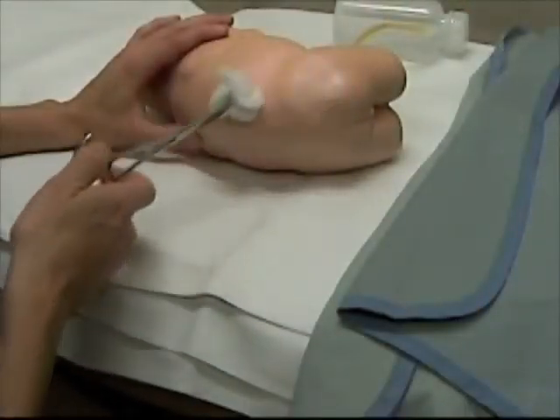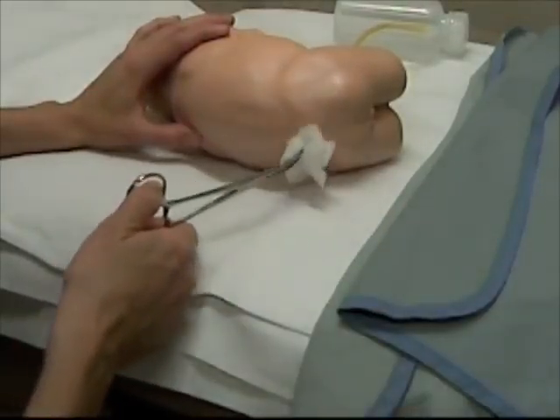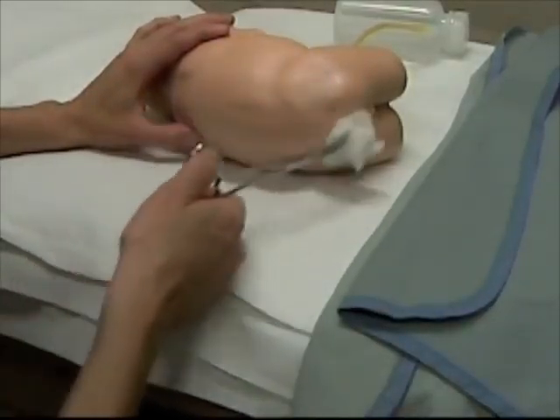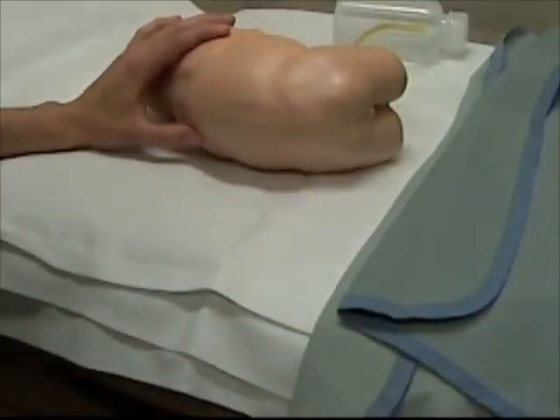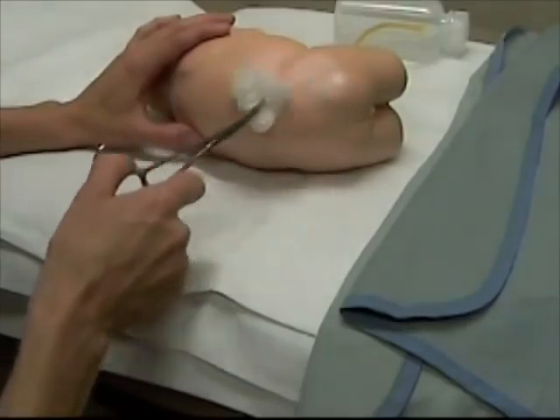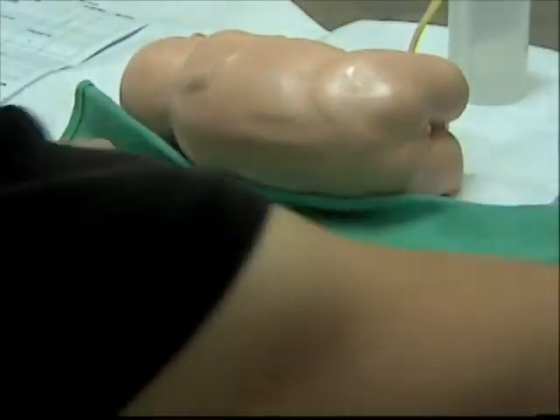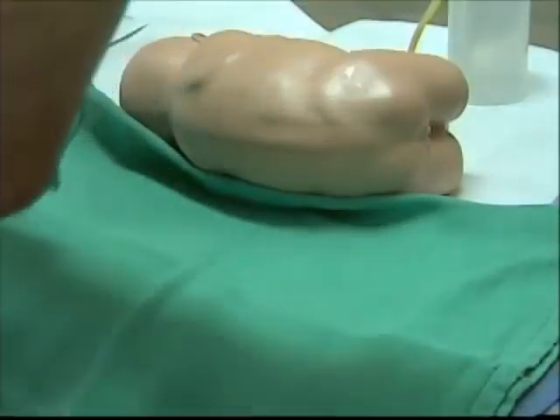Cleaning of the site should be performed in a circular motion, working from the inside out. Clean well beyond the area you will drape with chlorhexidine and betadine. Do this 3 times. The baby's diaper should be off by this point. Place your drapes so as to create an opening through which everything is sterile. There are a number of different ways to drape the child. One is shown here.